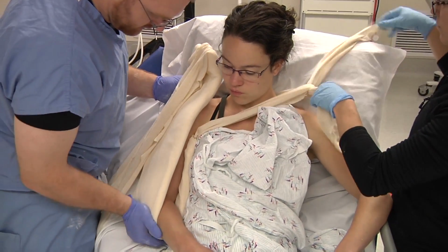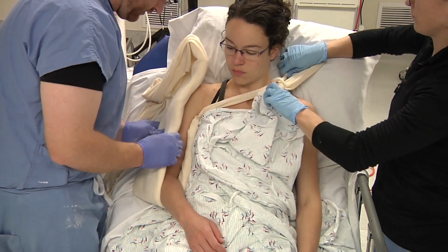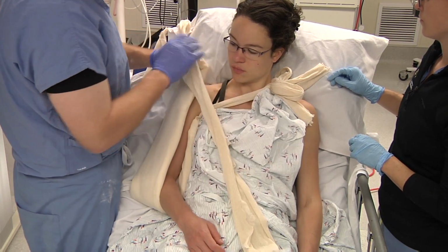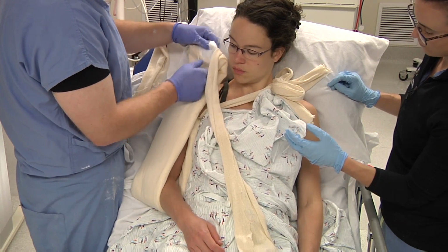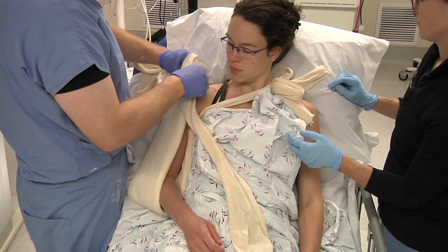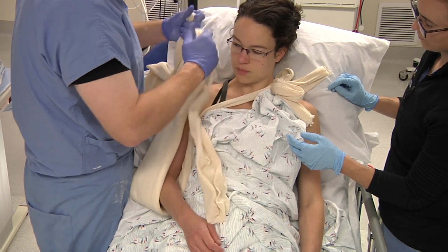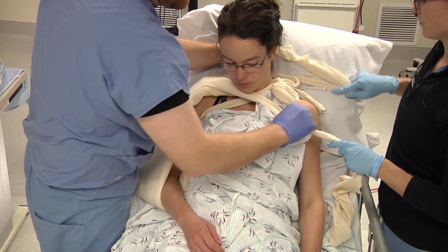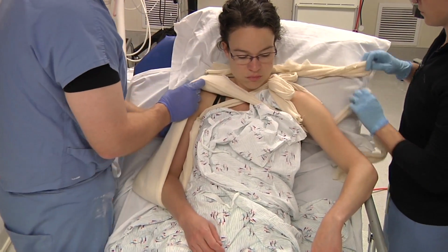Bring the splint, cradling the patient's elbow, up their arm on the lateral aspect. If you need to extend your splint, you can do that. If it comes up too high, you don't want to cause any compression in the neck. If you need to roll back some of your padding or your plaster, you can do that at this time. You do want it to come up a little bit past the humeral head. Extend your splint if you need to, and wrap up around the patient. This one is somewhat better done if you can wrap the upper one underneath the arm to get a crisscross pattern.